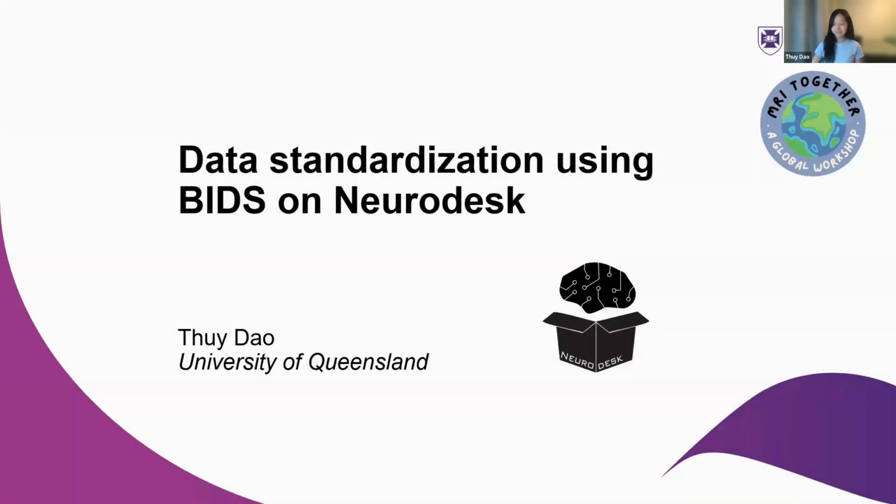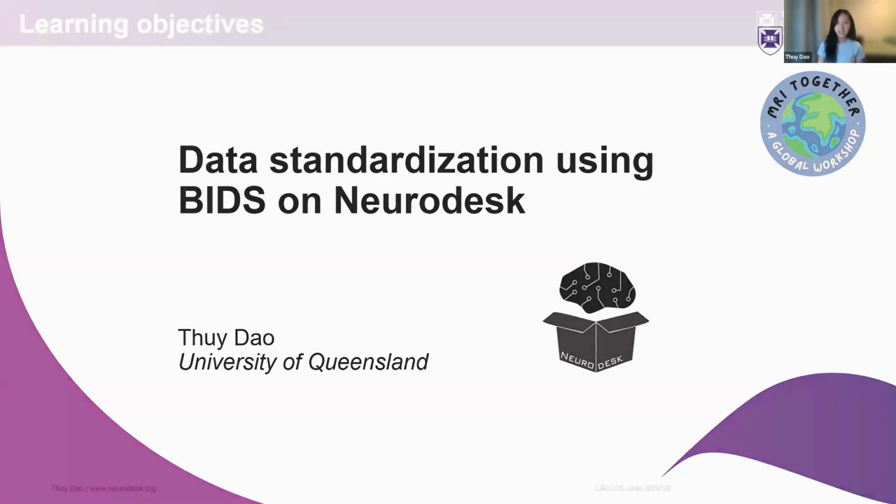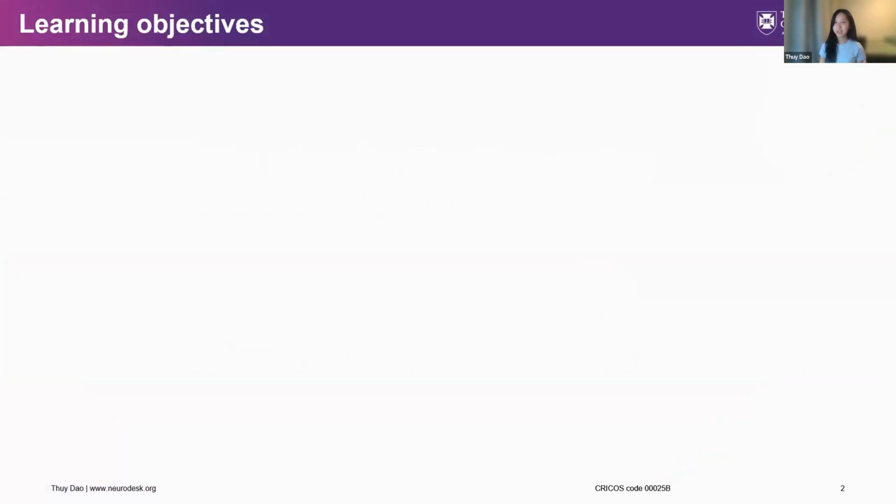So, thanks for the invitation to give a talk in this session, and I'm excited to walk you through a very cool topic today. First, I will go through the outline of this talk. I want to introduce to you a very powerful combination of tools and standards to efficiently manage and process neuroimaging data.